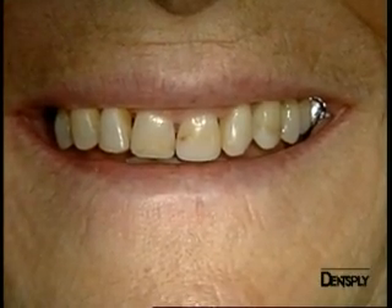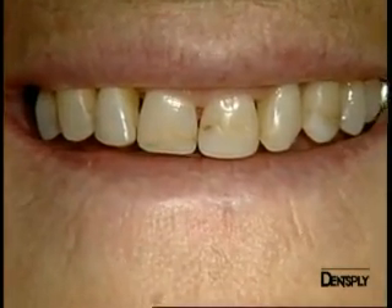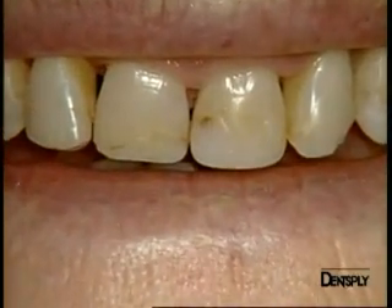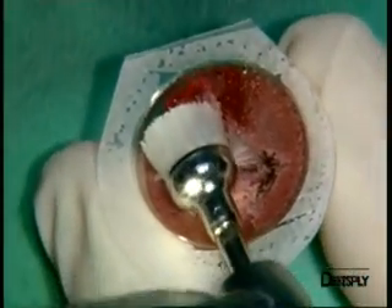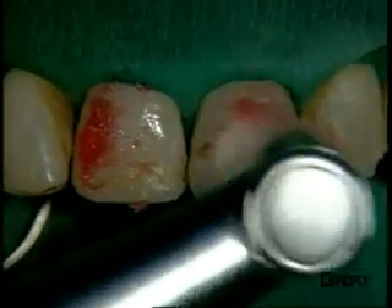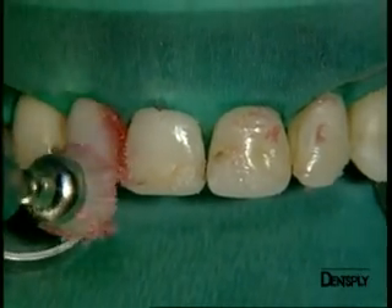We had a 60-year-old patient with several composite restorations that exhibited marginal micro leakage and looked quite unsightly. After having cleaned and prepared the cavities, we are now going to place the adhesive and then restore the teeth with the aesthetics micro matrix composite.